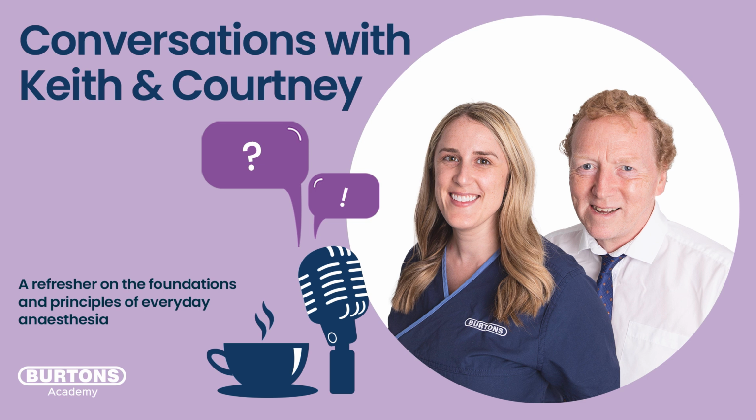And by close, we've got to think about nowadays oxygen concentrators. They don't deliver 100% oxygen. They deliver somewhere between 93 and 97%. So you're getting pretty good oxygen levels, certainly enough to overcome any problems with hypoventilation. As long as your patient is taking a breath every now and again, it's not going to be hypoxic due to lack of oxygen being delivered.